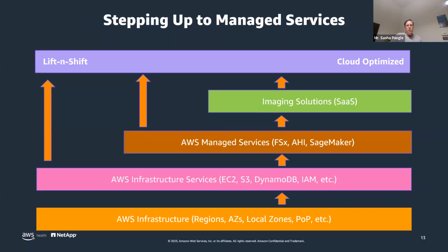All right. Now, one of the key concepts that I would like everybody to appreciate is this concept of a managed service. And thinking about the maturity of applications, you may be choosing to do this yourself: can I host an imaging solution, a PACS solution for example, in the cloud? You take the approach of lift and shift, which is really being able to mirror what you're doing on-prem in the cloud, using infrastructure services to deliver an imaging solution.